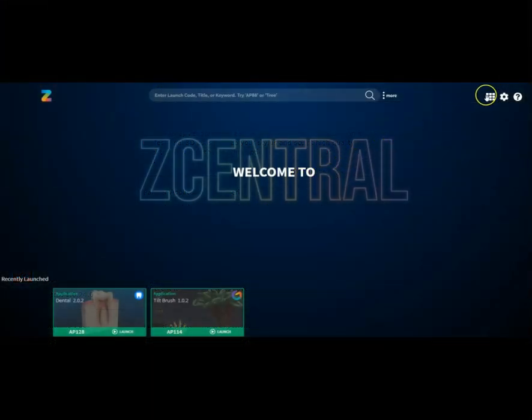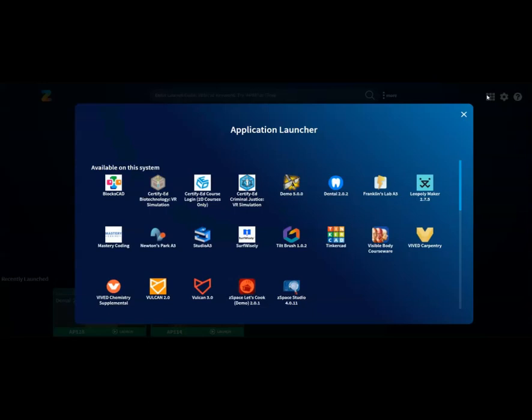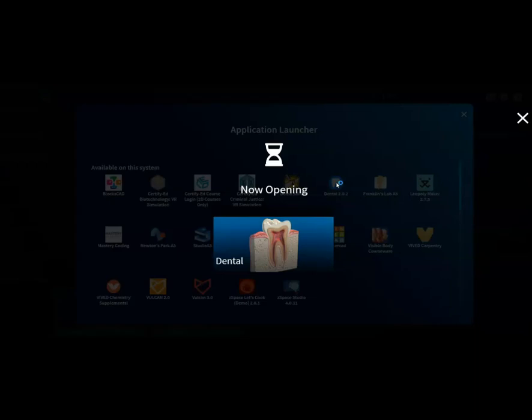Once Leopoly Dental is installed, you can close App Manager and open up zCentral on your desktop. Click the application launcher in the top right-hand corner and launch Leopoly Dental.